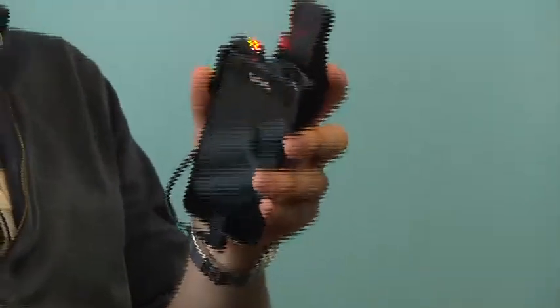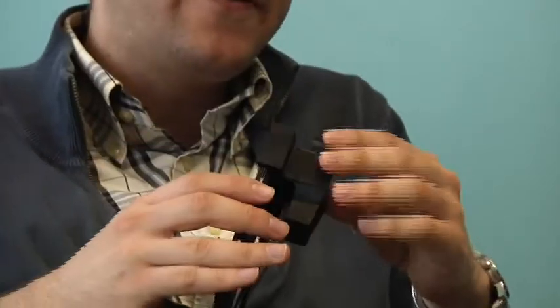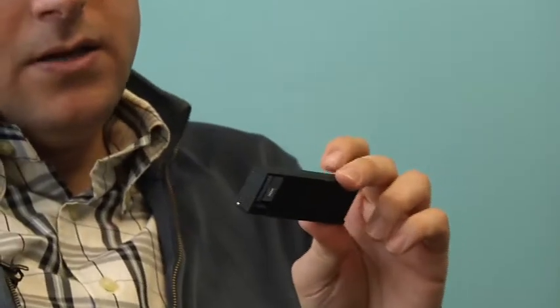This is not a microscope, what I'm showing here. It's something more universal than a microscope, in the sense that this is a digital universal reader for rapid diagnostic tests. Rapid diagnostic tests are tests that you can use to diagnose diseases like malaria or HIV or TB or sexually transmitted diseases. Literally, there are hundreds of different types of rapid diagnostic tests, and it's like a pregnancy test in the sense that you have to read it manually.